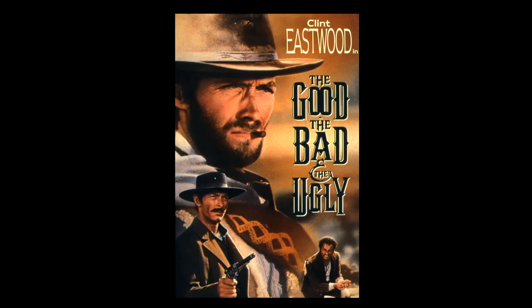I always like to think about soft tissue tumors as Clint Eastwood's old movie, The Good, the Bad, and the Ugly. If I know what that is, that's good. If I don't know what it is, I always think of things that it could be that are bad, and by doing that, I make sure things never get ugly.